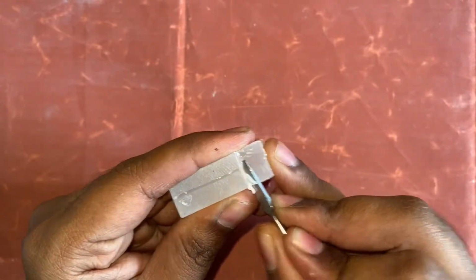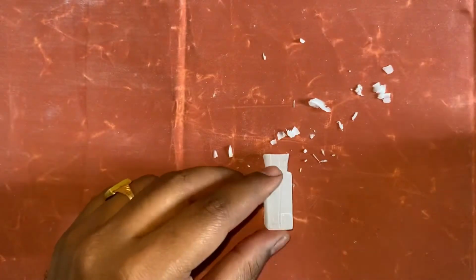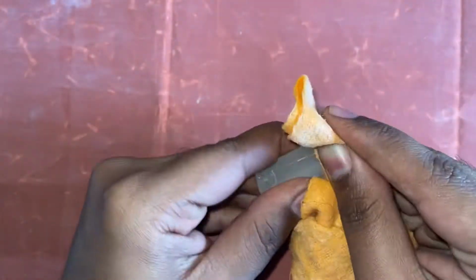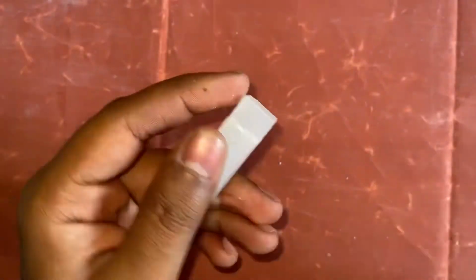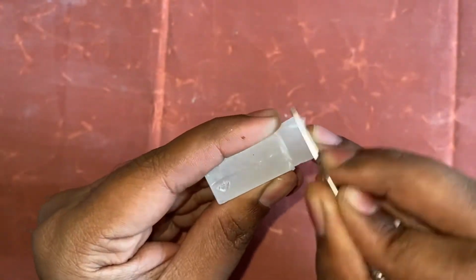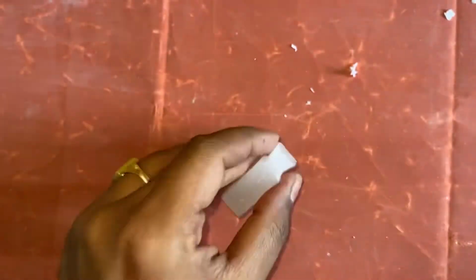Now scrape out the wax from the sides of the wax block and see that on both the sides you have removed the wax equally. Now with the help of a polishing cloth, polish the surface to give it a smooth finish, and again gently scrape out the excess wax so that you get the accurate mesiodistal measurement, which is 5 mm.